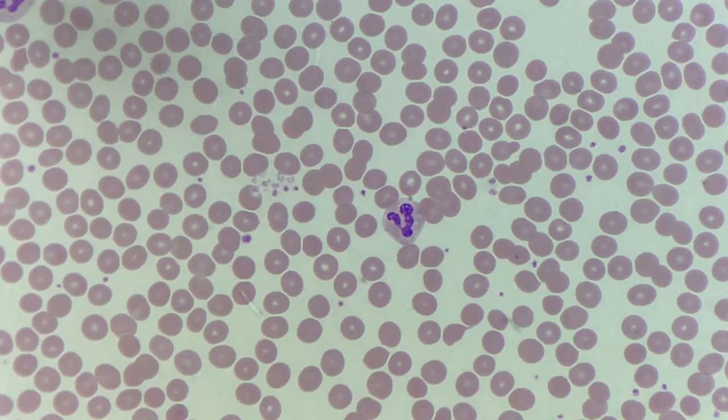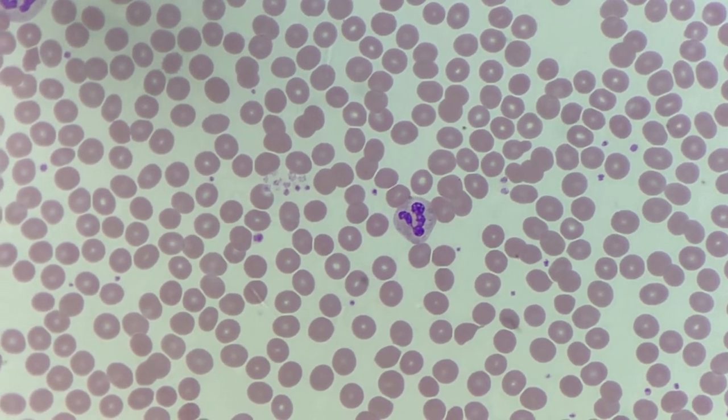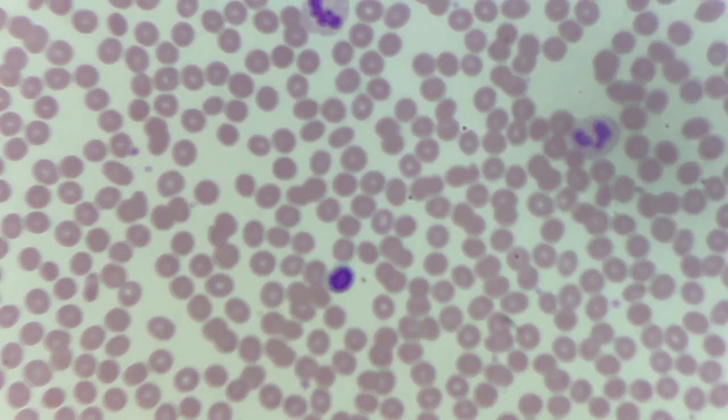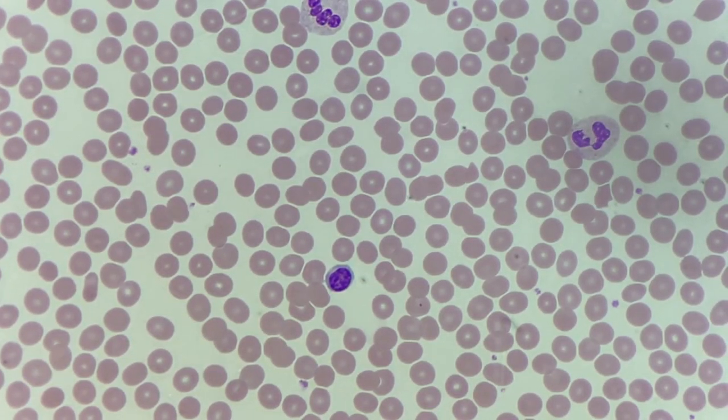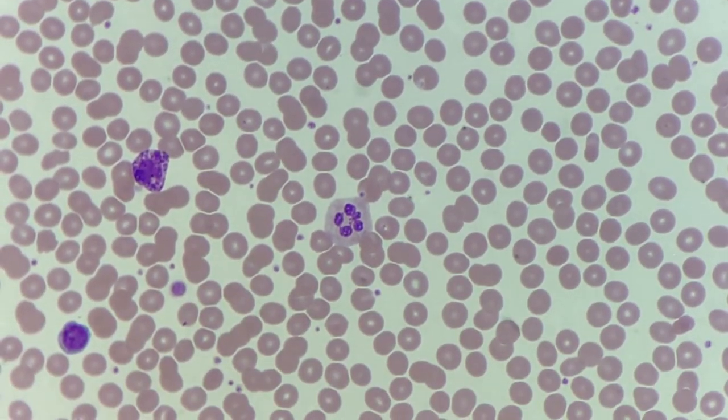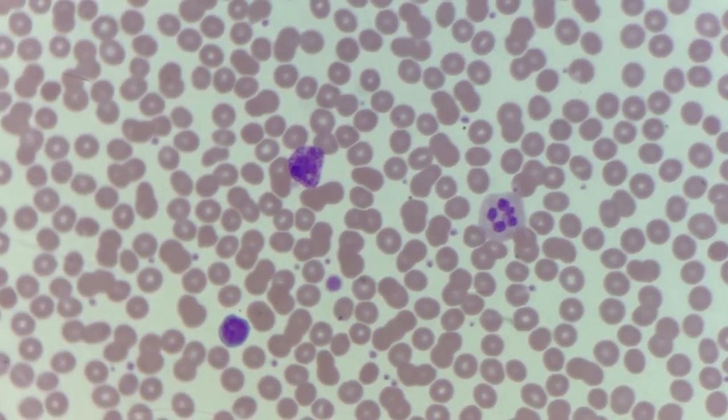Anything containing nuclear material, such as the nucleus of the white cells, stains a purple colour. The neutrophil is one of the granular cells, and so fine granules should be visible in its cytoplasm. The clumped appearance of the chromatin within the nucleus is a sign of maturity. Here we can see a basophil with its deep purple granules.